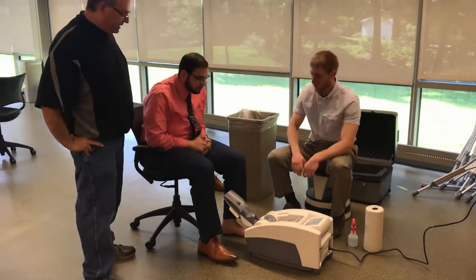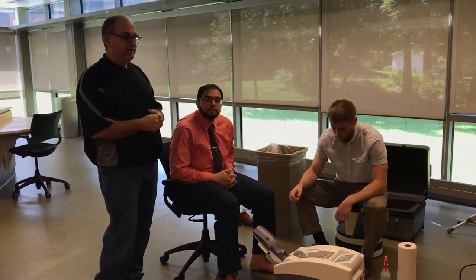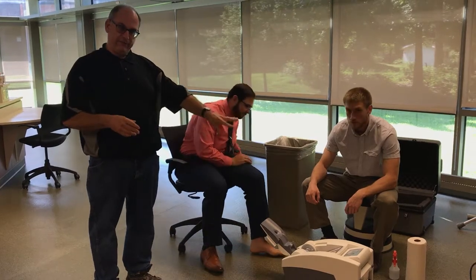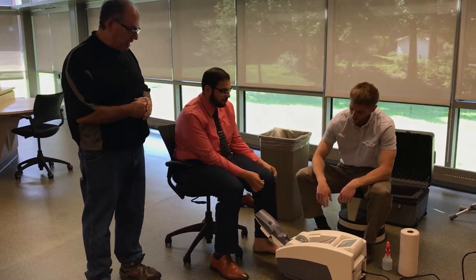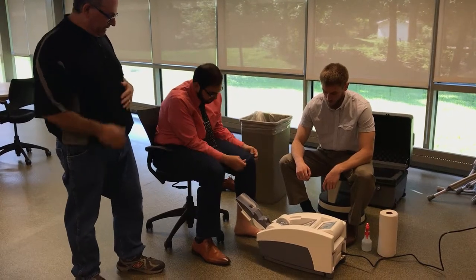What you're going to need your patient to do to get ready is to remove their shoes and socks. For females wearing hose, they have to remove that too. You have to have bare skin up to the ankle — it's got to go above the ankle bone at least to be able to get an accurate test. Have your patient take off their shoes and socks, and pull up their pant leg if necessary.